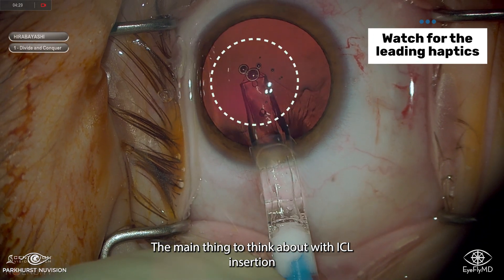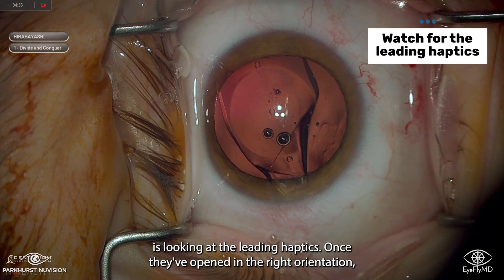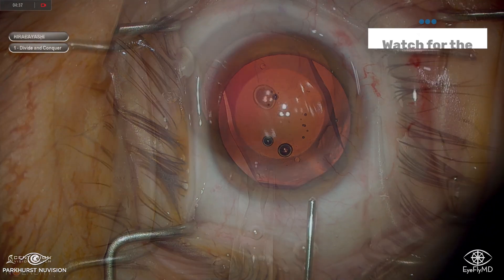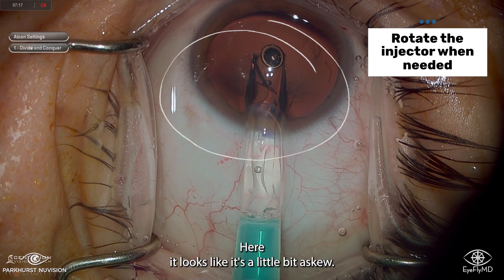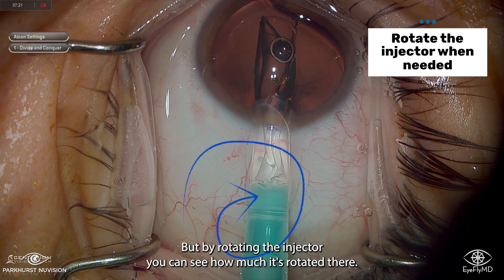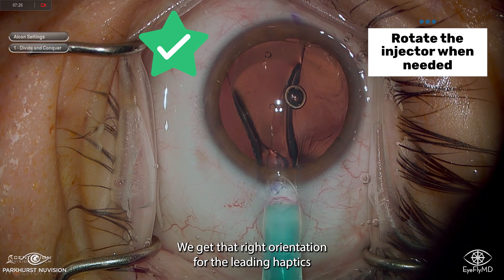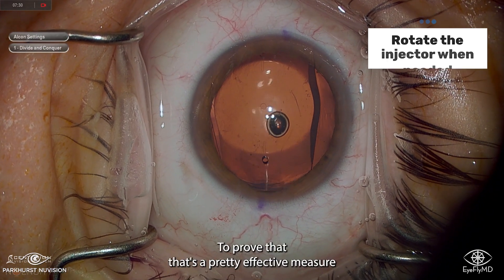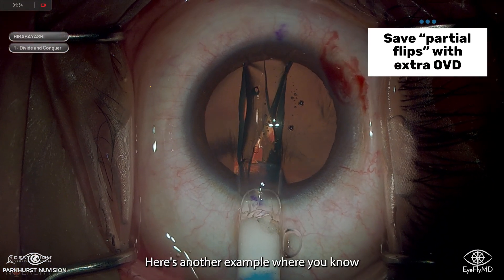The main thing to think about with ICL insertion is looking at the leading haptics. Once they've opened in the right orientation, you know you've made it and can commit to the rest of the insertion. The ICL never needs to flip upside down because you can always use that as a marker. Here it looks a little askew, but by rotating the injector you can see how much it's rotated — then you get that right orientation for the leading haptics and commit to the insertion.